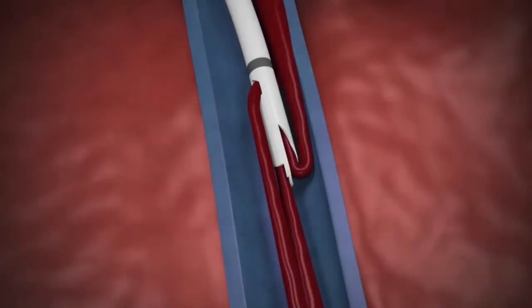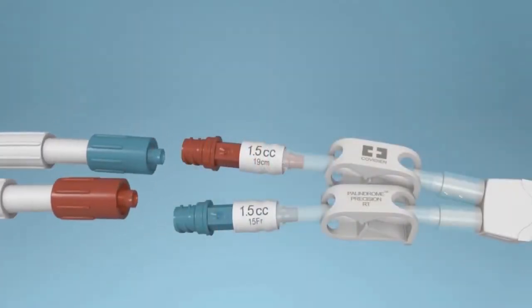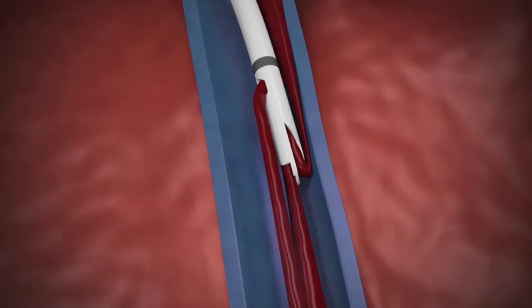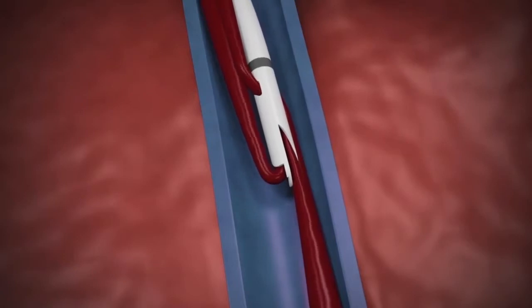The unique symmetric tip of the Palindrome Precision Chronic Catheter minimizes recirculation not only in forward flow, as most catheters are designed to do, but it also provides minimal recirculation rates when the lines are reversed. Reversing dialysis lines is a common practice in dialysis therapy and is often necessary to restore catheter function. If a catheter is occluded or clotted, reversing the lines is often the only option besides replacing the catheter to restore adequate flow and dialysis treatment for the patient.